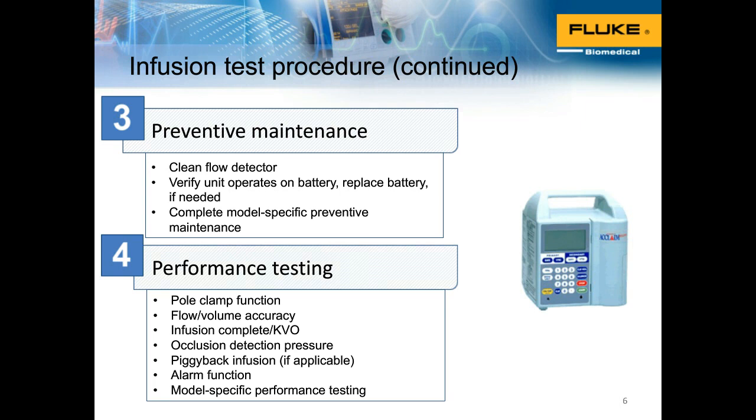The next thing is preventative maintenance. You want to make sure that the flow detector is clean. You want to verify that the unit will operate on battery correctly. There are so many instances we hear that biomeds are called to the floor because the pump is not working, and it's the battery that's to blame. It's either been discharged completely or it wasn't replaced based on the interval it was supposed to be replaced on. So batteries tend to be a big headache.